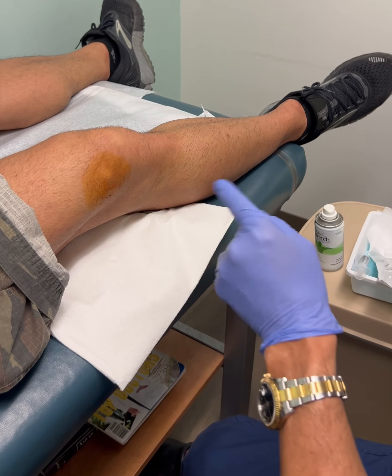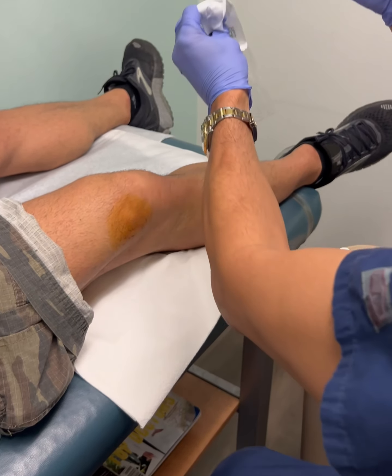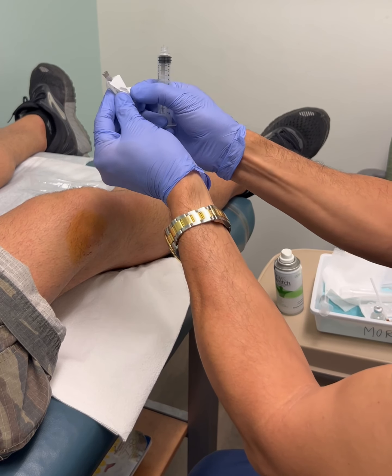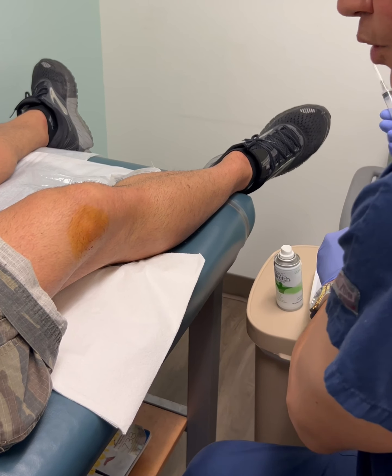Go nice and slow with the lidocaine so it doesn't burn too much. Let it sit for just a few seconds. Then prepare a 10cc syringe with a 22-gauge needle. I'm taking my time setting this up so we can let that lidocaine work.